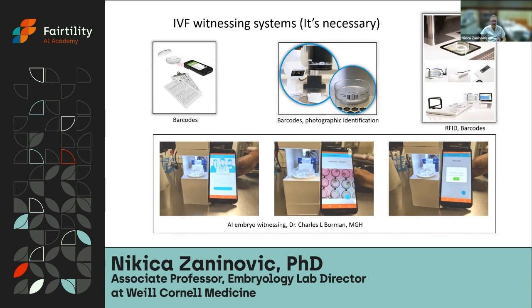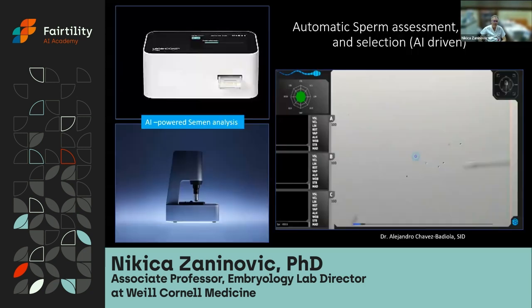So we have a different witnessing system on the market. However, we can actually use AI for witnessing. And actually, there is a development that you can use AI even on your cell phone that will recognize the image of the embryo, each embryo, from one day to another. So it's going to recognize this is the embryo that belongs to this particular patient. And the next day, if you click the image on that embryo, it's going to tell you what embryo it is and who this belongs to. So it's very interesting that we can use AI for witnessing now.